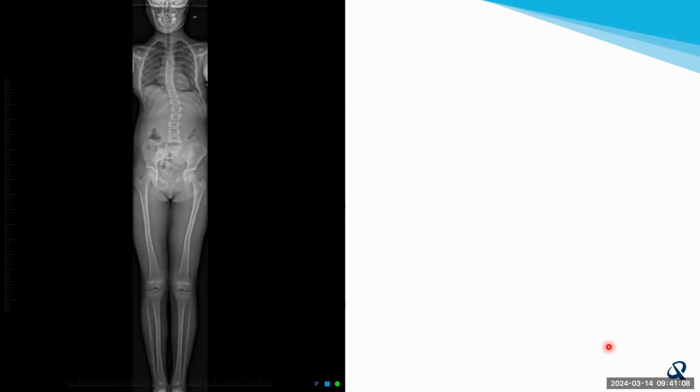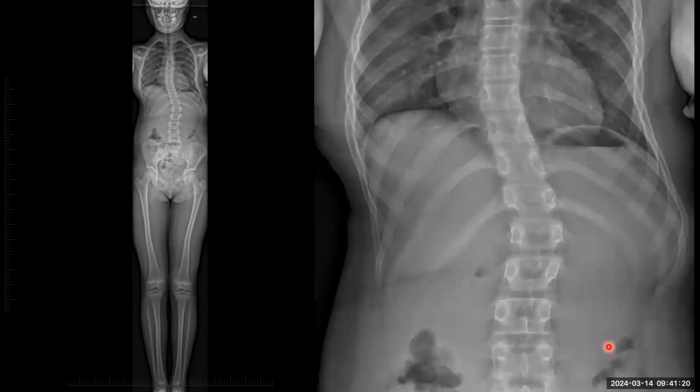So here's a patient that came through Bowen Hills, actually, who looked initially like they have a thoracolumbar scoliosis convex toward the right. But if you look closely at the image, you can see that it's not quite right. It doesn't look like a scoliosis. The end plates aren't angled relative to each other. And then everything looks like it's shifted toward the left. So these ribs are sort of poking out on the left. These ribs are poking in on the left. You can see that the waist is accentuated on the right.